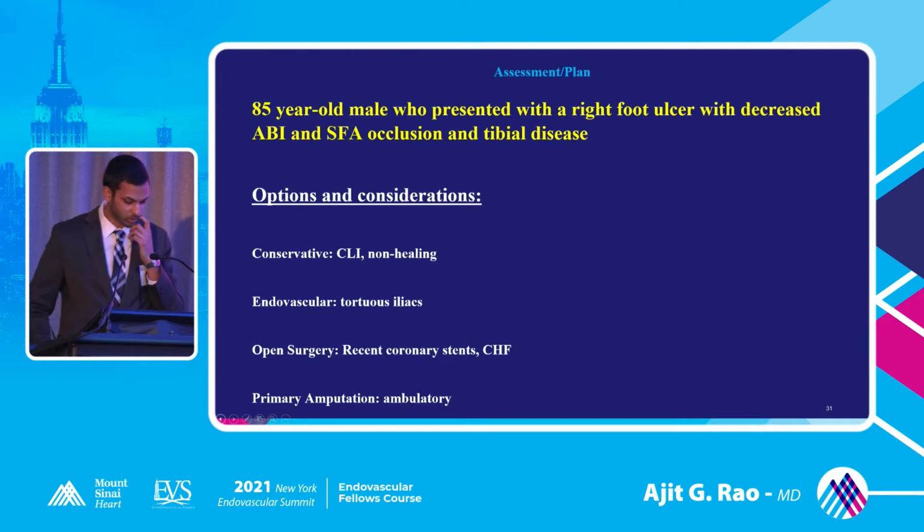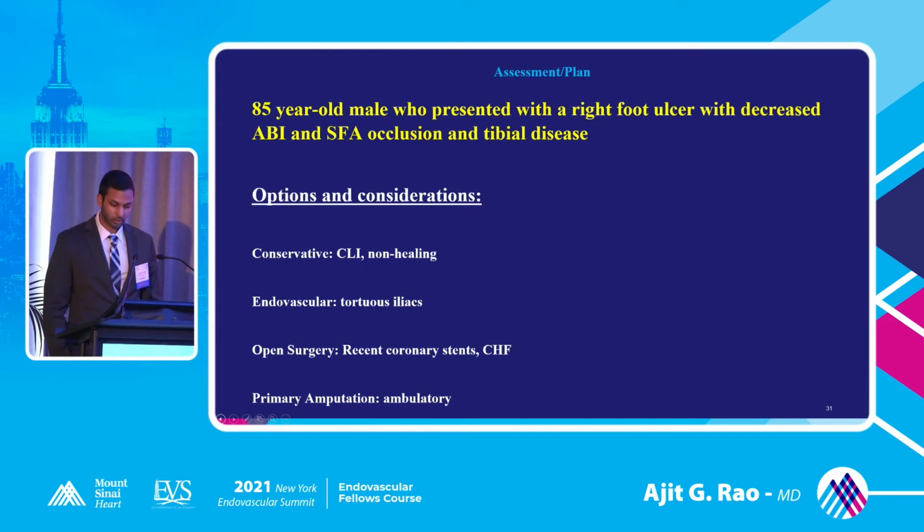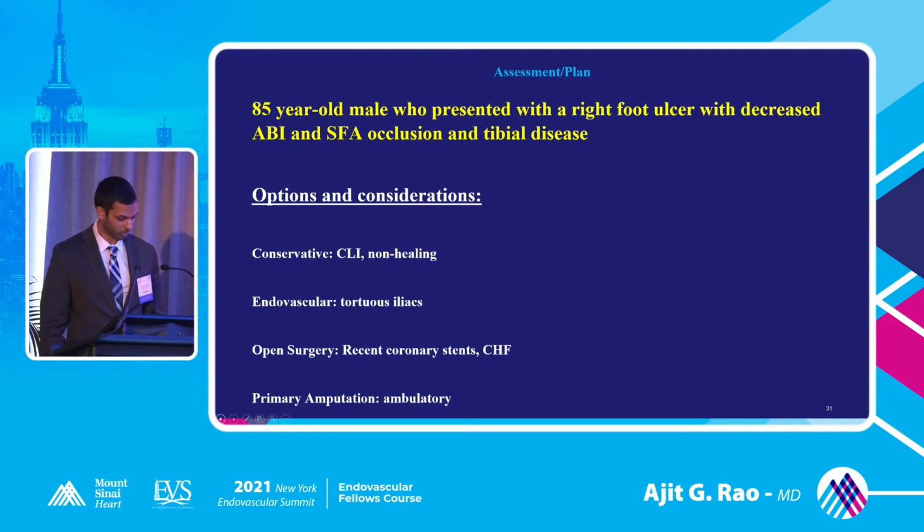So what are your options here? As Dr. Lantis just mentioned, conservative management obviously isn't good to try to save his leg. Endovascular option is definitely a good option, but as we mentioned, there are some challenges with the iliacs. So going up and over would be challenging, even to get a catheter, let alone a sheath. Even antegrade access would also be difficult because the femoral artery is occluded just past the origin.